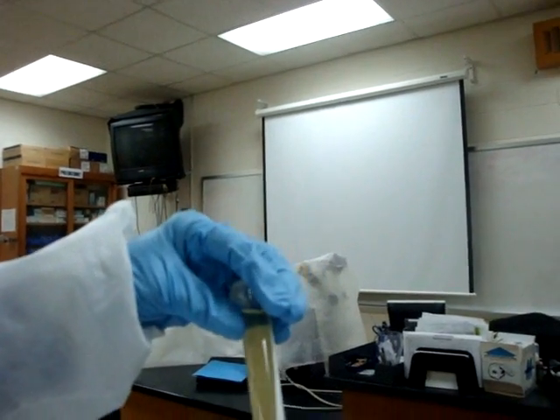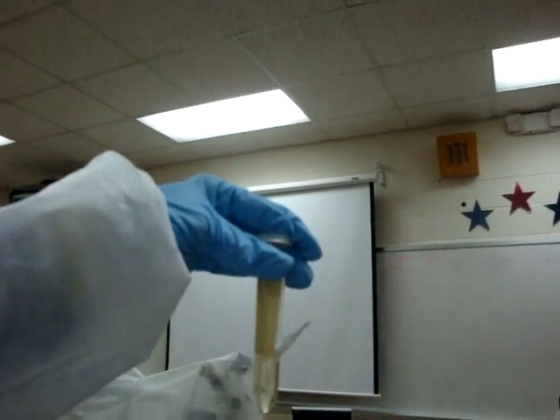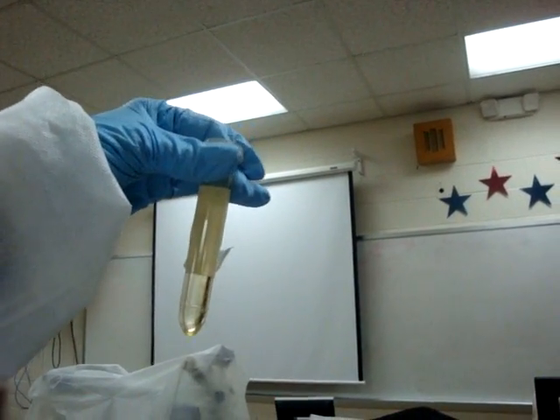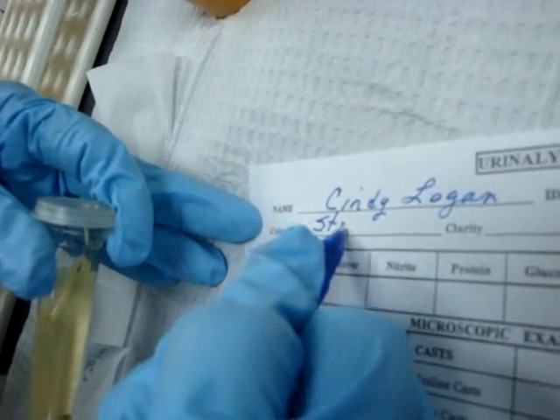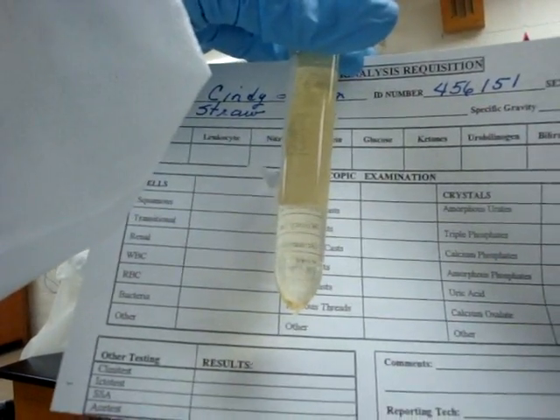Now we are ready to read our urine color. If we look at the urine color we may have to remove the label a little bit so we can see it. This is a pale yellow, or straw — we could call it either one — and we will write the color. We can tell that it is clear because we can read through it, so we will write down clear.